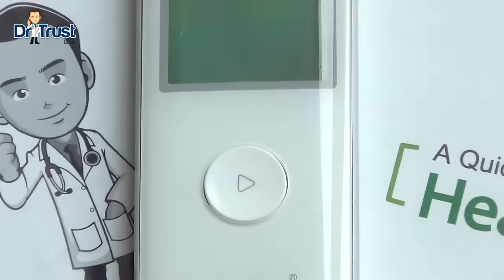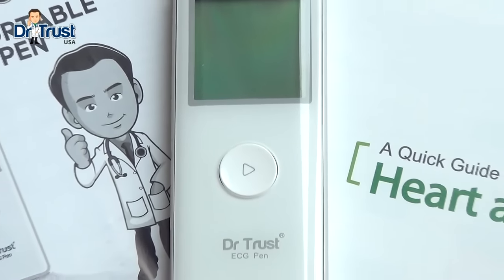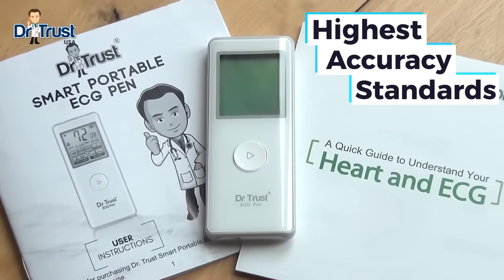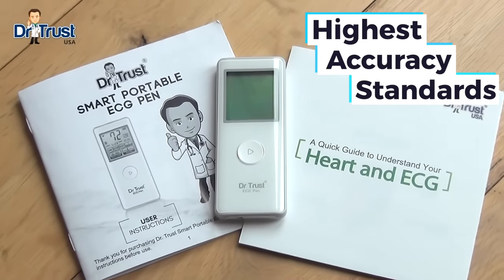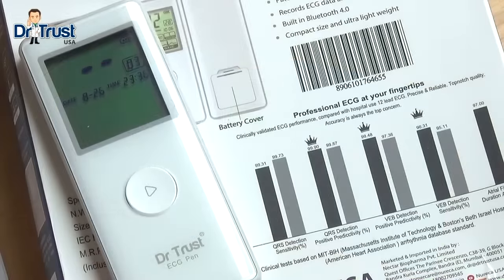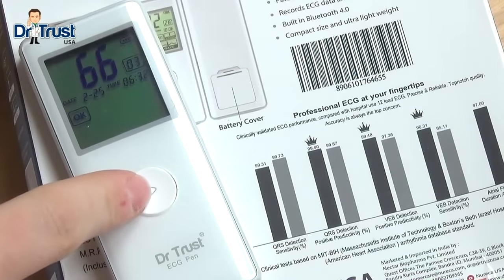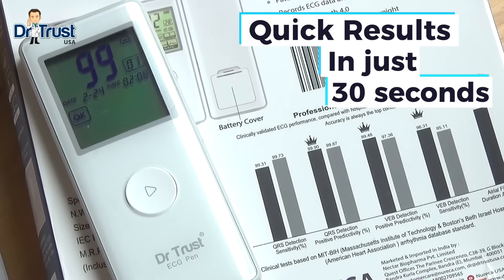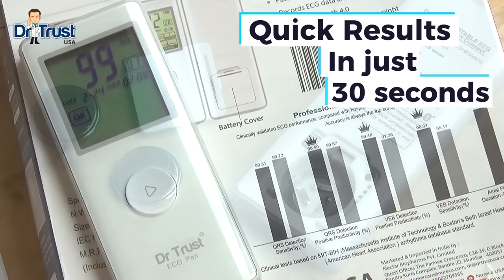This US FDA and CE approved device brings you the highest accuracy standards, comparable to a hospital grade 12-lead ECG. The Dr. Trust ECG Pen records your heart rhythm and then gives you information on mean pulse value and deviation from a normal ECG result in just 30 seconds.